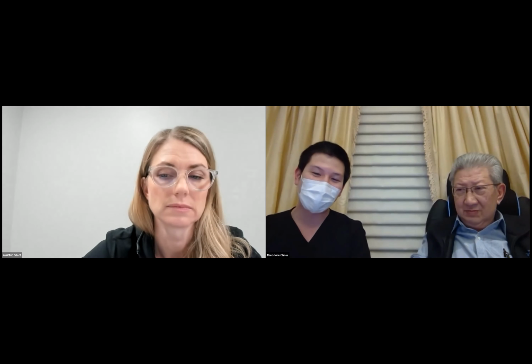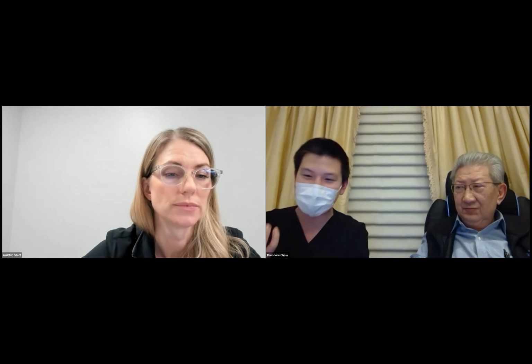That's one of the issues I have with fitting. When I see the lens on the eye and I see a little bit of pooling, should I drop it down a little bit? But the ability of my eye to discriminate that pooling is really poor. I do go by SPK, then I raise it up a little bit. If there's not enough targeting, I maybe have to increase the force or decrease the sag a little bit. Then, if I hit SPK, oops, I went too much. Unfortunately, I haven't found a way to avoid that trial and error as of yet, and I would love to be able to determine it more accurately.